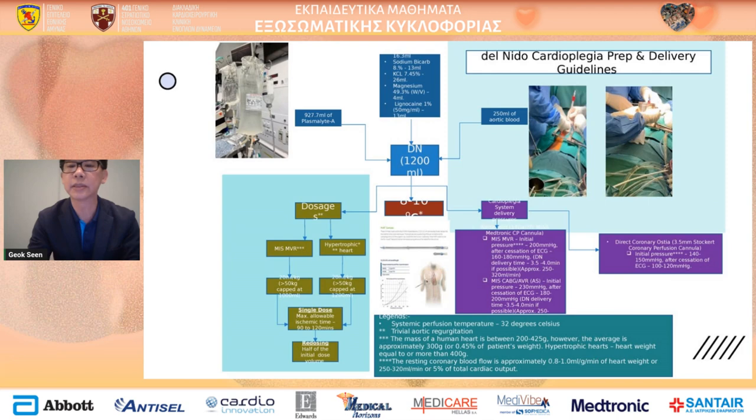And once the aorta or axillary line is cannulated, we harvest some blood out, which is whole blood, and you have to put the patient in Trendelenburg, because otherwise you will get into a hypotensive problem. So head down, so that you can momentarily secure better hemodynamics.